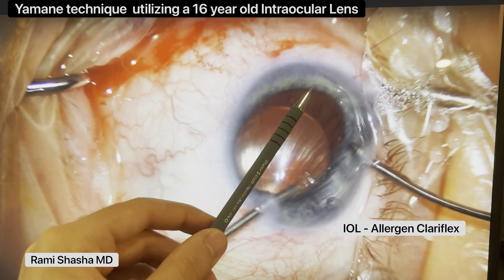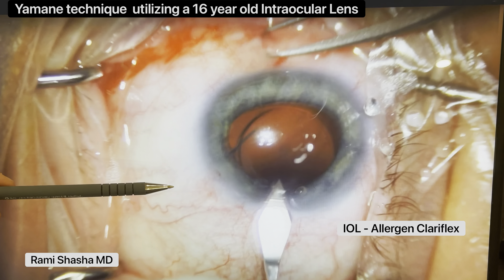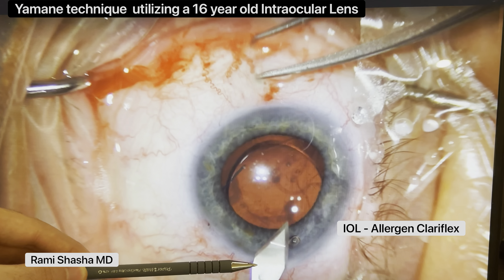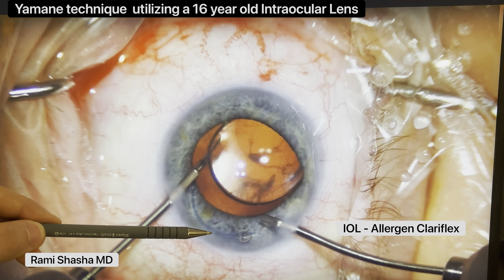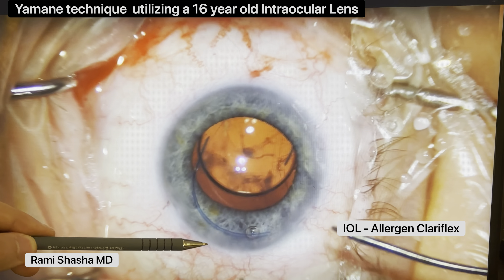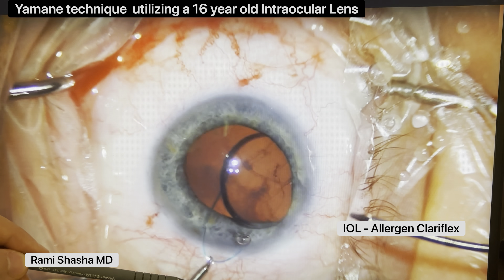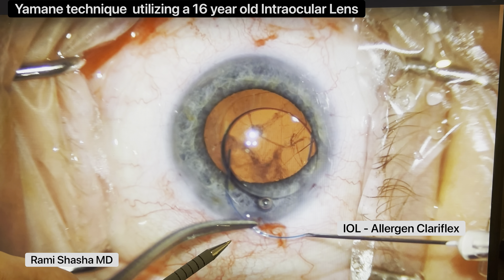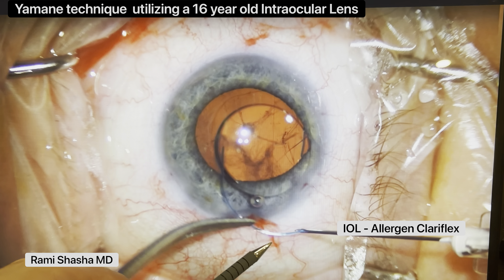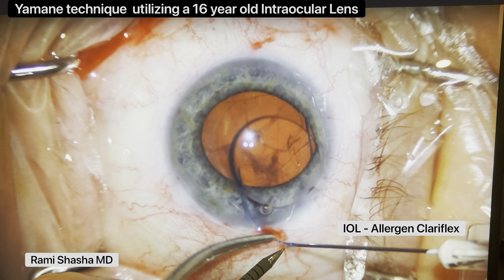The reason why I'm doing this is because I want to check the integrity of the haptic and to see whether they can accept the 30-gauge TSK needle. So to do that, I'm going to also create my main wound. Here you're going to see that I'm going to push out one of the haptics out of the eye with my micrograsper, and then bring out my 30-gauge TSK needle. I just want to make sure that these haptics — because remember, this is almost a 16-year-old IOL — go in nicely into the 30-gauge TSK needle.